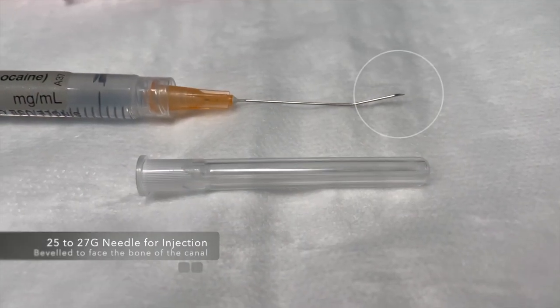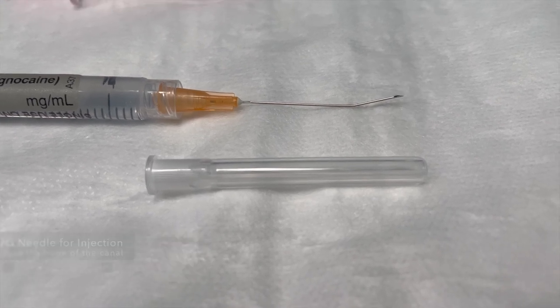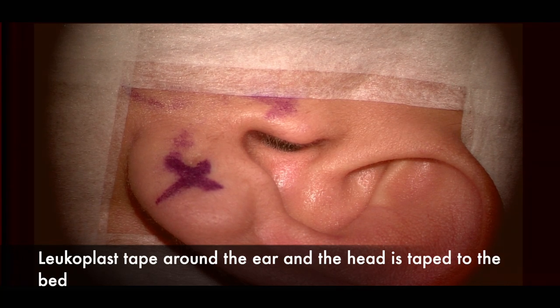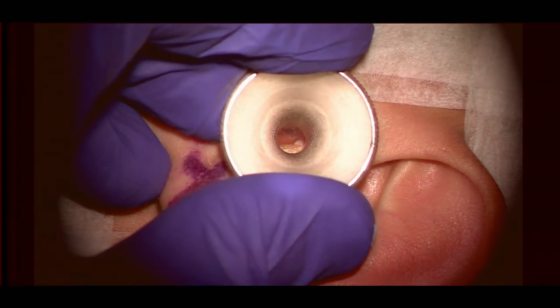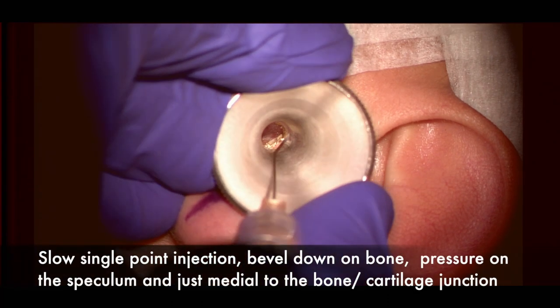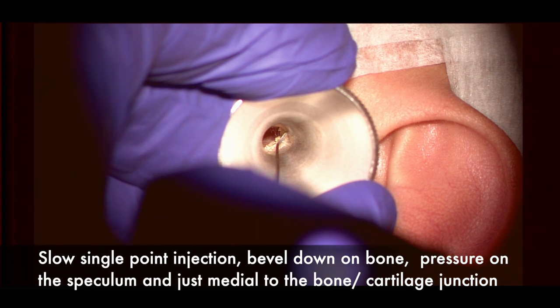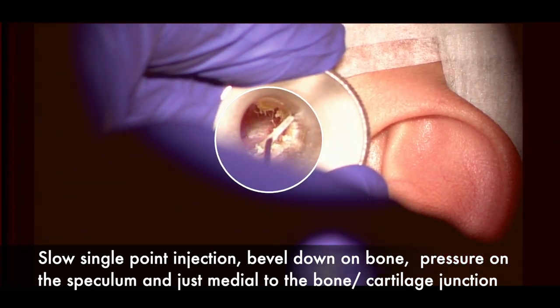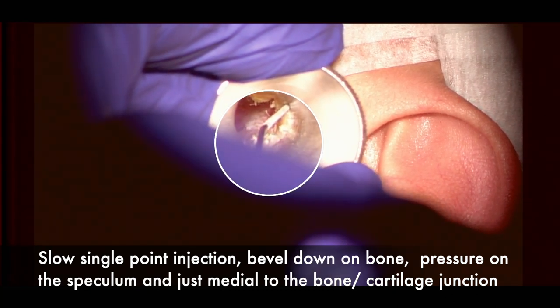The injecting needle is beveled to 15 degrees to face down towards the bony canal. The injection is begun after preparing the ear with leucoplast tape around the ear, and the head is taped down to the bed. We use a speculum — ideally a black one, but here a silver one — with a slow single-point injection, bevel down onto the bone. You can see blanching and swelling of the skin superiorly.